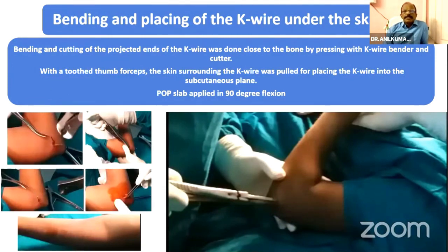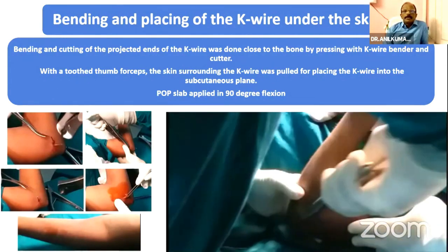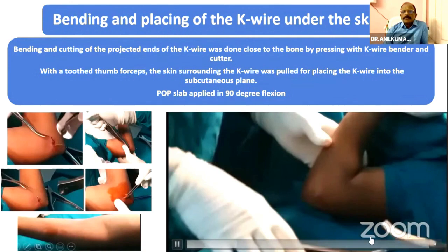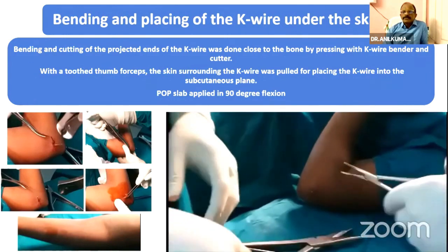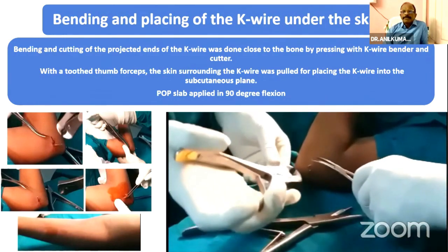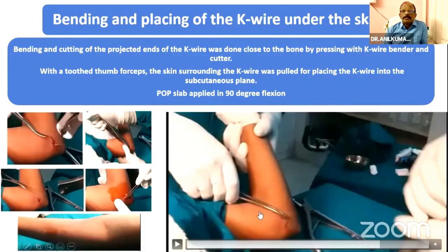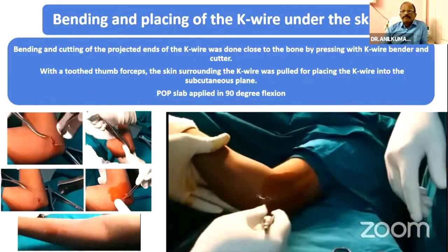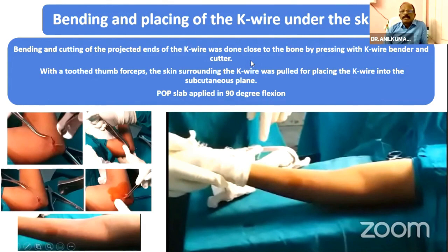The end of the K-wire is bent and placed in the subcutaneous plane with the K-wire bender and also the wire cutter. We can see the bending of the K-wires and cutting short by giving deep pressure towards the bone. The end of the wire is placed into the subcutaneous plane by pulling with the thumb forceps, so that nothing will be seen outside, and a POP slab is applied in 90 degrees of flexion.